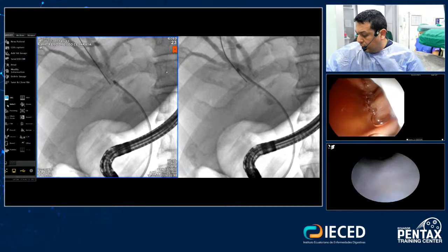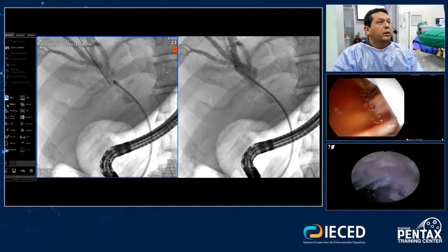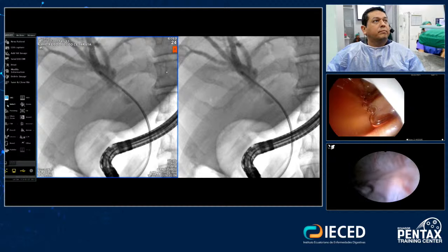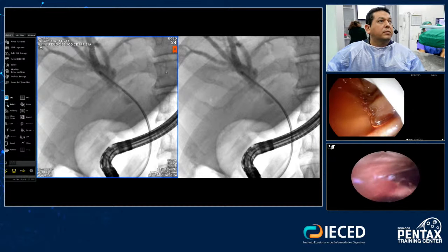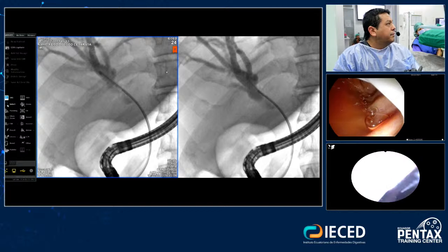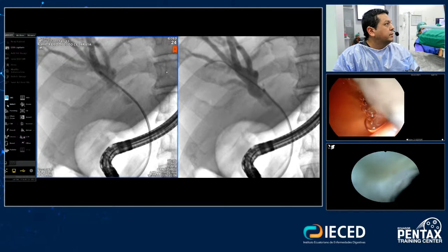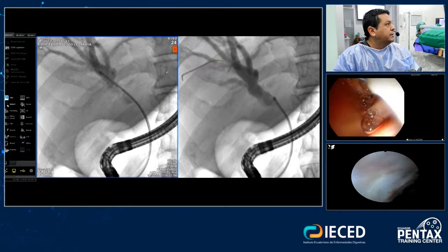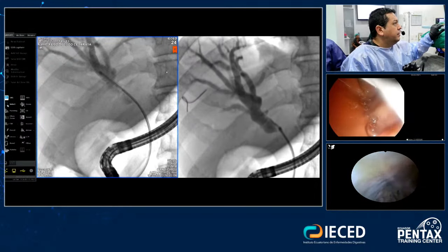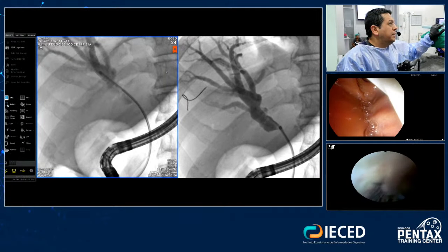Esta es la guía. Quiero jalar. Ok, jala la guía. Sí, necesito ver la bifurcación. Sí, estamos bien. So we have a space. Empuja la guía. Sí, sigue, sigue. We have a space, and I want to show you very well the track here. You see here. I believe we have a lot of space here.